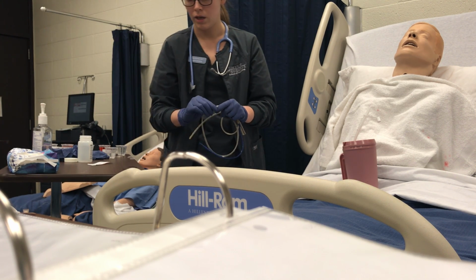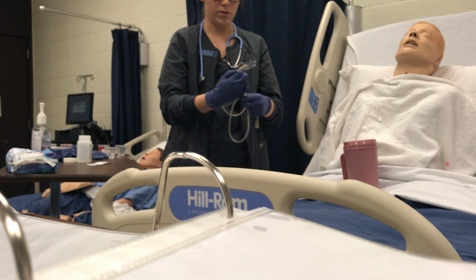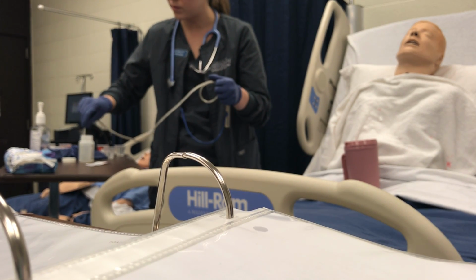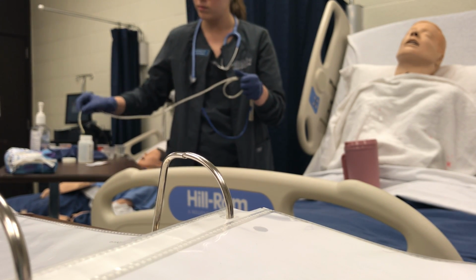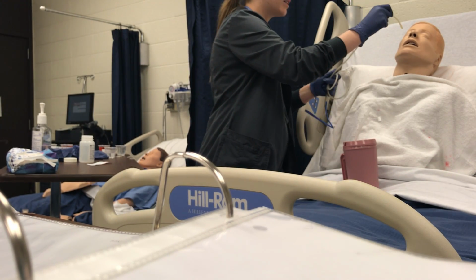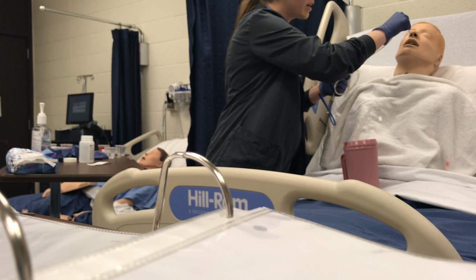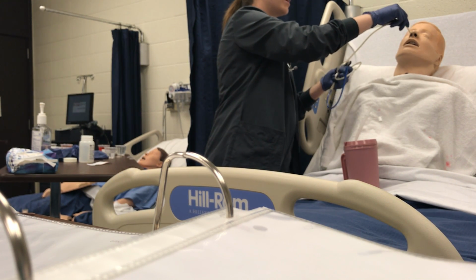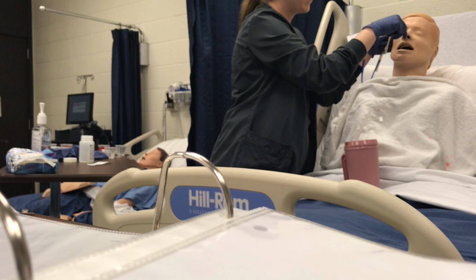Okay, so once I have that ready to go, I'm going to lubricate the tip of the catheter 4 inches. And I'm going to place the curved side down. Take a deep breath and be ready to go. Okay, and then I would check in the back of the oropharynx. It is there now, so I'm going to have him extend the neck forward.